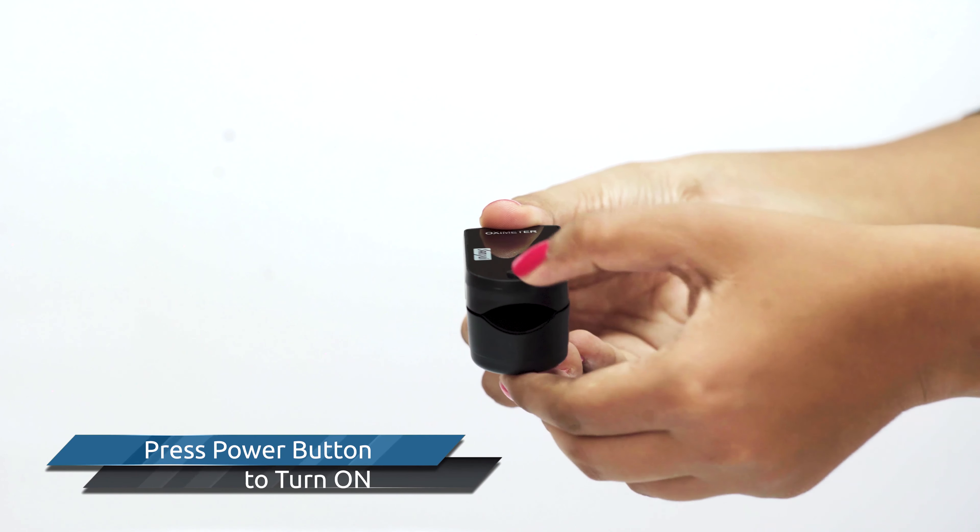Please do not shake your finger in the process and don't keep yourself in motion. Please keep it on a flat surface for the best reading. If you want to change the display direction during use, press the button in the middle of the front panel.